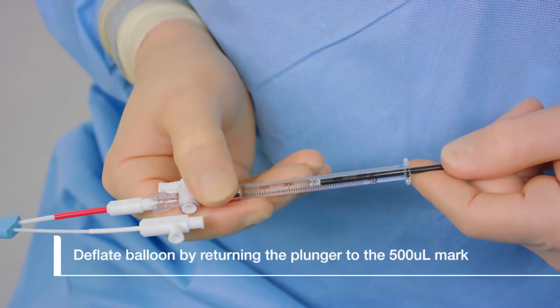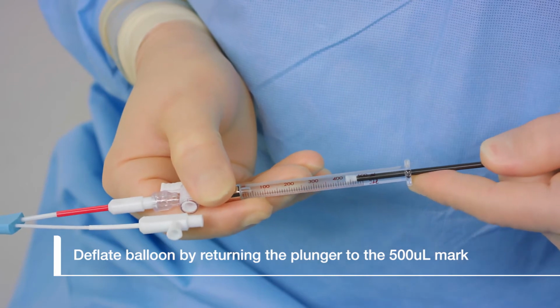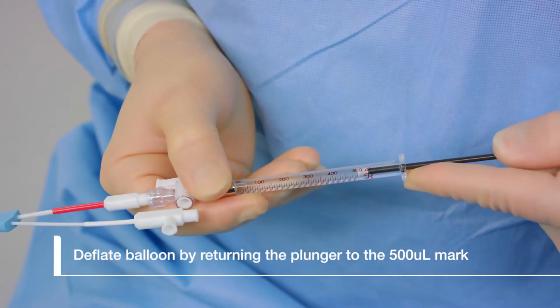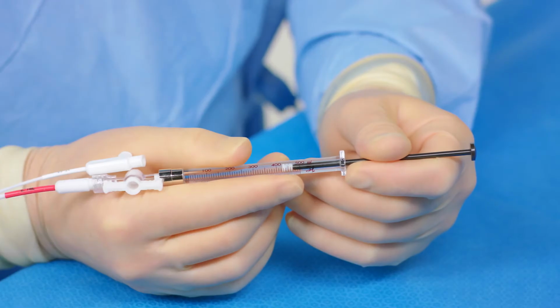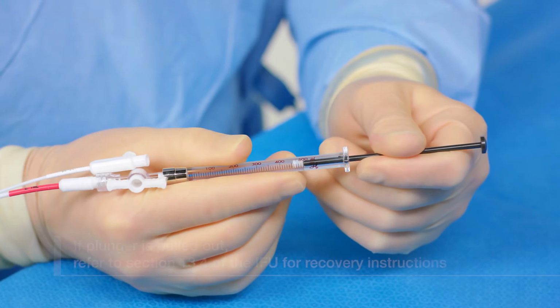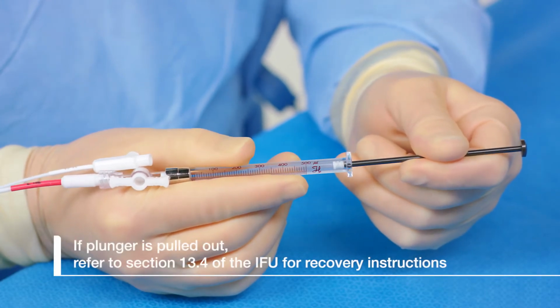Before retracting the balloon inside the bronchoscope, fully deflate the balloon by returning the plunger to the 500 microliter mark. Take care not to pull the plunger beyond the 500 microliter mark. If the plunger is pulled out, refer to IFU for recovery instructions.